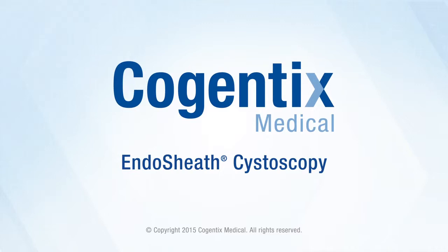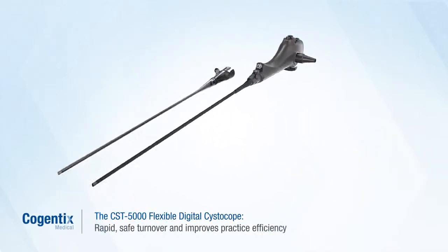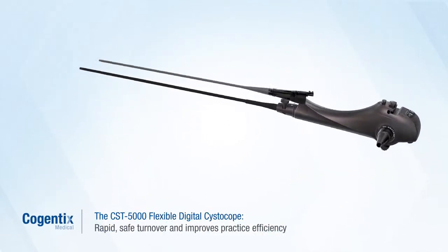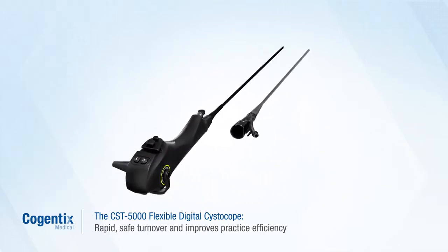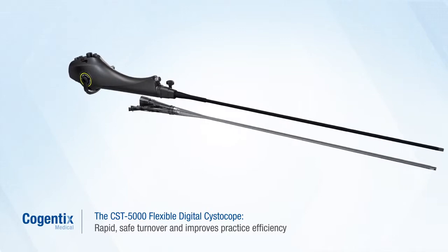Endosheath cystoscopy from Cogentix Medical: an always ready, always sterile solution for you and your patients. The integrated Endosheath cystoscopy system delivers rapid, safe turnover between procedures without increasing capital investment, for improved practice efficiency and profitability.